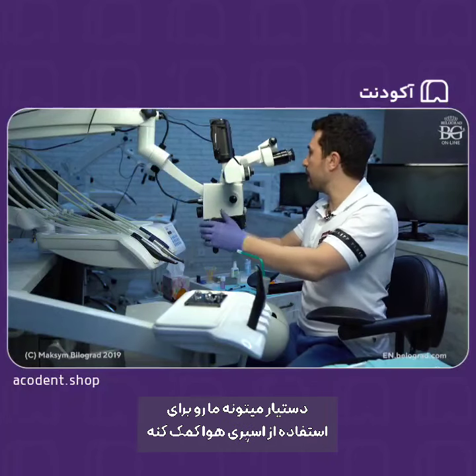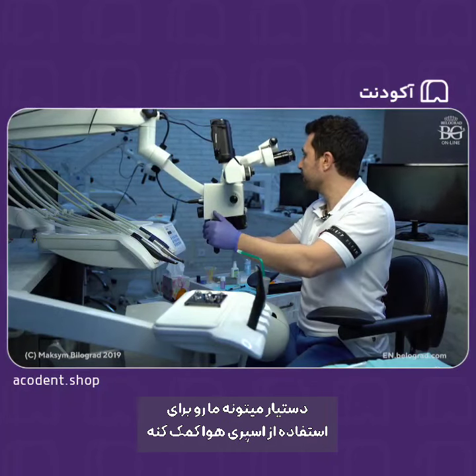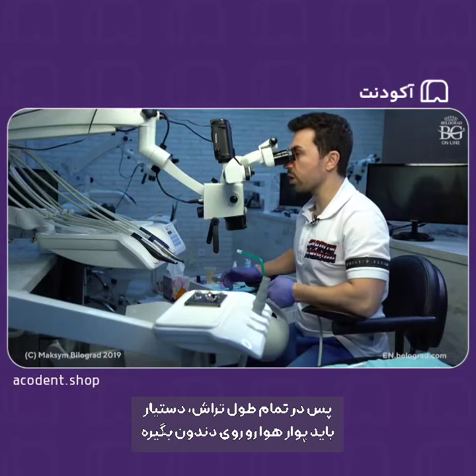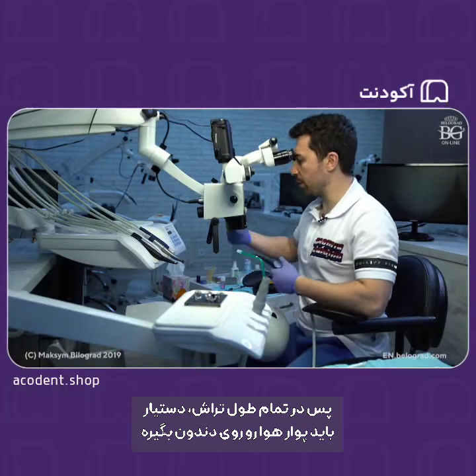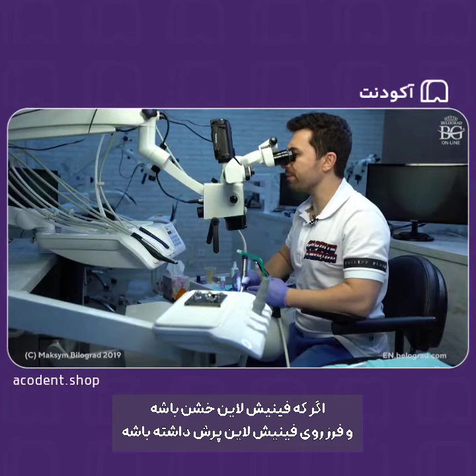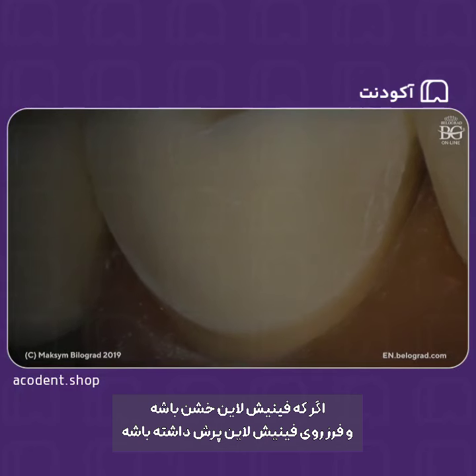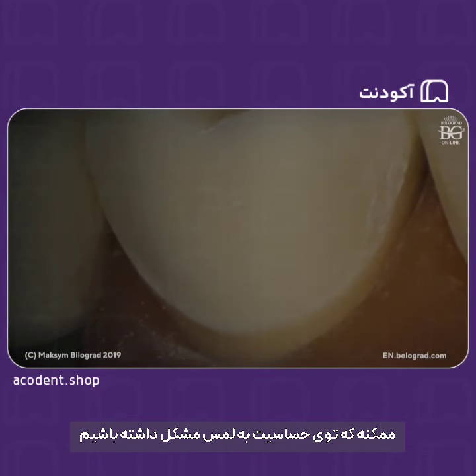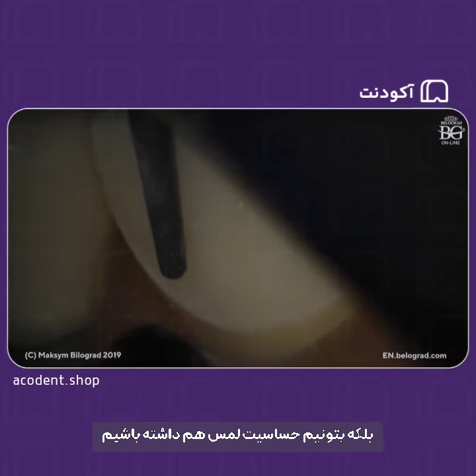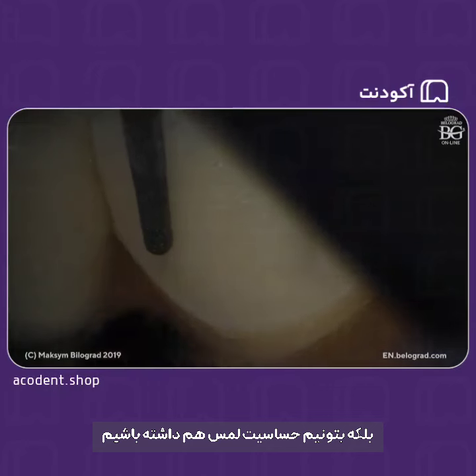And also what is important, our assistant helps us with air spray. The assistant works with air spray all the time you prep. But at really low speed, you may feel by tactile sensitivity if your finish line is rough, if your finish line is jumping, your burr is jumping over the finish line. So that's why we also use this speed, not just not to overheat, but also to have tactile sensitivity.